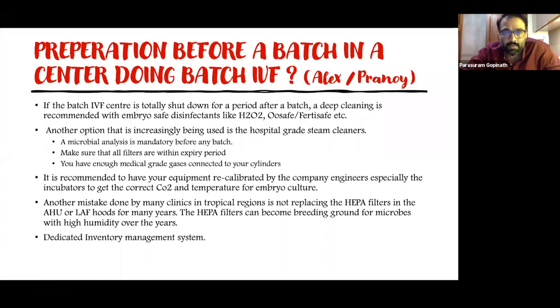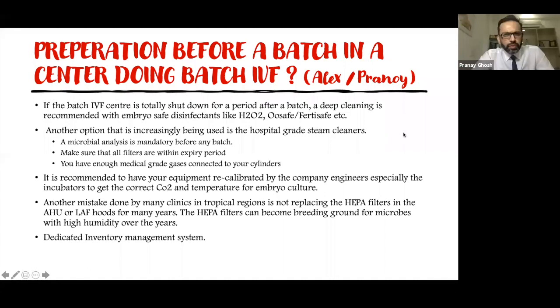Yeah, you need to be mindful that things can fail during a batch, so you should be keeping some items in duplicate, like your oocyte aspiration pumps, the bulbs, and spares for your stereozoom microscope and inverted microscope. And once you receive the media for that particular batch, it is ideal to perform the pH testing for that particular lot of media, as you do with all your media, and do a sperm survival test.